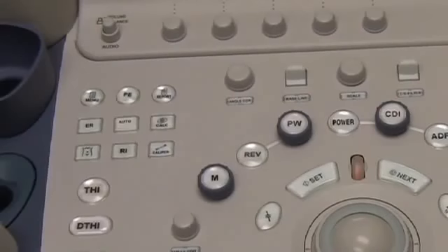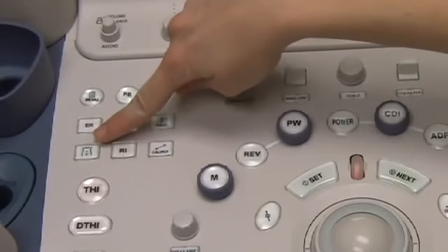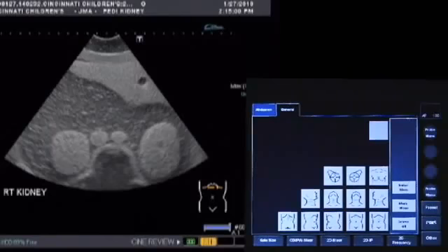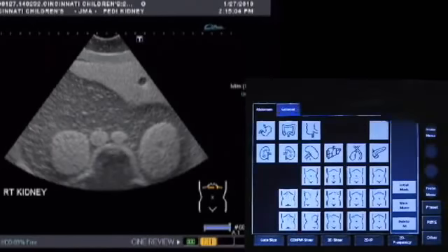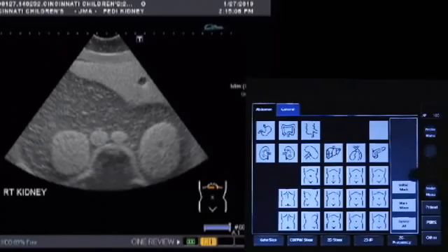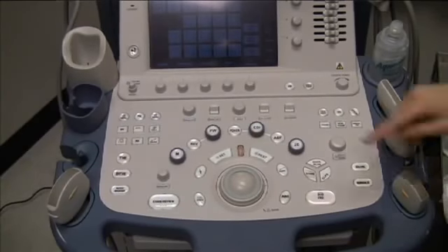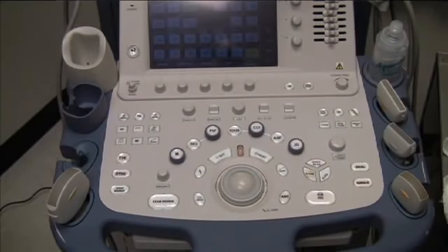To label the anatomic location of where you're scanning, press the body marker button — it will illuminate when active. Then use the touch panel to indicate the location where you're scanning. After labeling the appropriate location, press the body marker button again to exit this function.